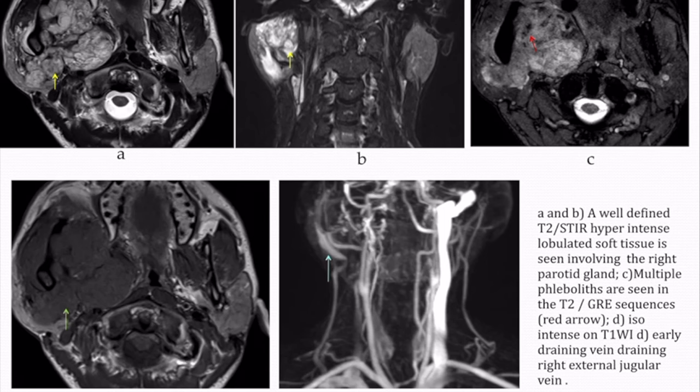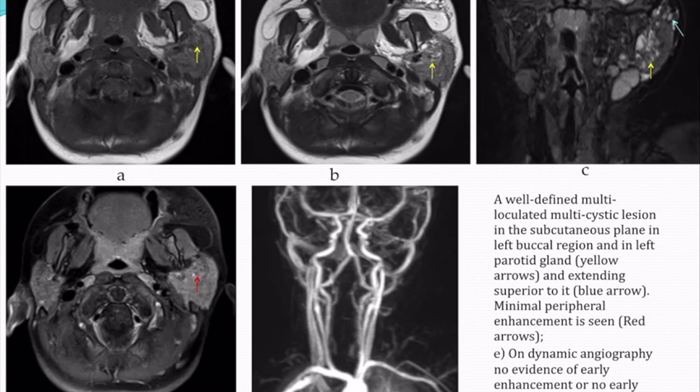A well-defined T2-STIR hyperintense lobulated soft tissue lesion involving the right parotid gland was seen. Multiple phleboliths were seen on GRE sequences. The lesion appeared hypo- to iso-intense on T1-weighted images, and an early draining vein running into the external jugular vein was identified. The diagnosis given was slow-flow venous malformation, based on the early draining vein.